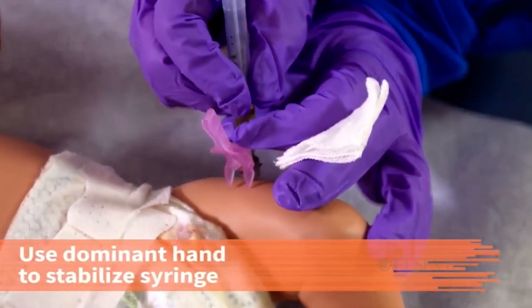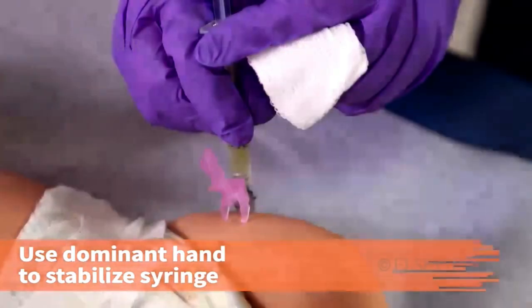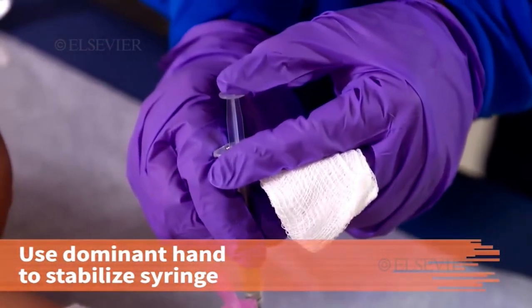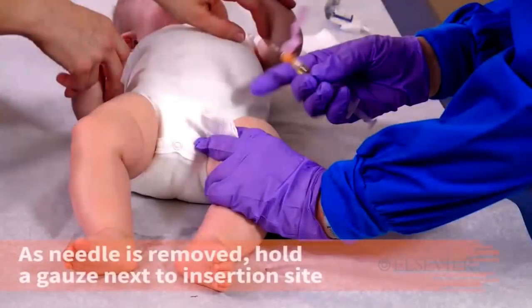To prevent discomfort for the patient, do not move the needle while injecting the medication. Use your non-dominant hand to depress the plunger. Aspiration is no longer recommended with pediatric vaccination injections, but you should follow the facility's policy. As the needle is pulled out of the skin, hold a gauze next to the needle insertion site.